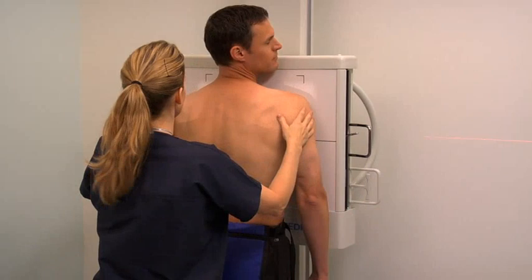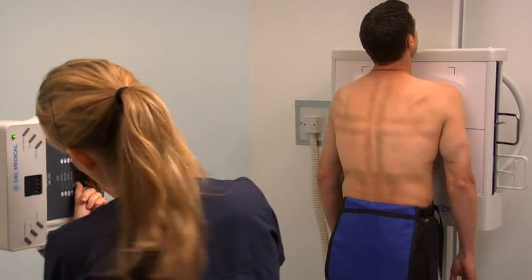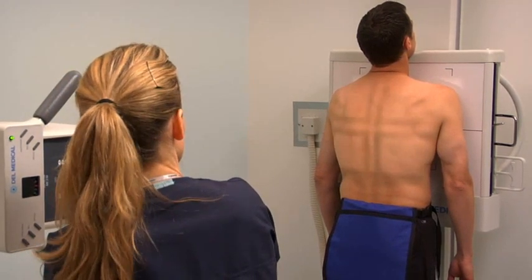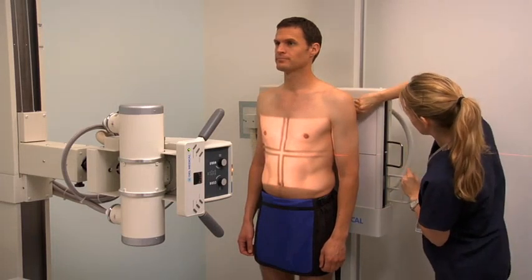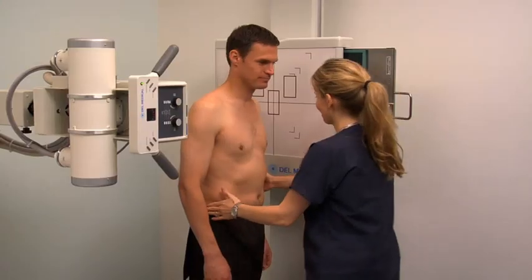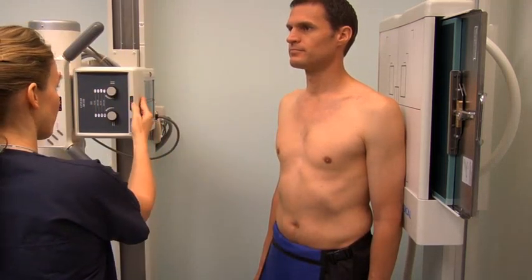The postero-anterior, or PA projection, is where the X-ray beam, or central ray, enters the posterior aspect of the body or body part and exits anteriorly. The antero-posterior, AP projection, is where the X-ray beam enters the anterior aspect of the body or body part and exits posteriorly. When the body is rotated medially or laterally, this is called an oblique projection.